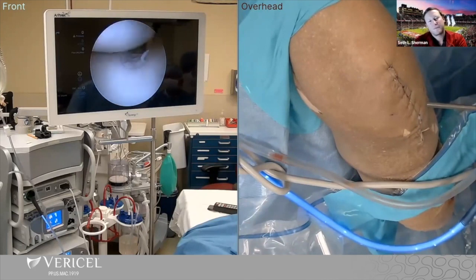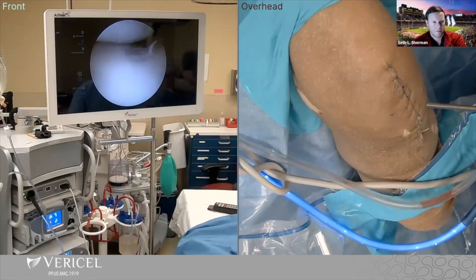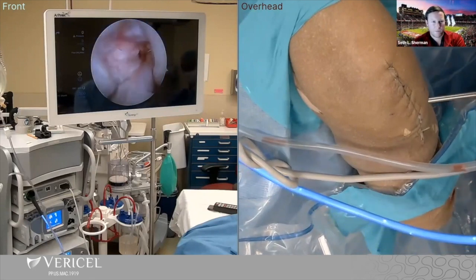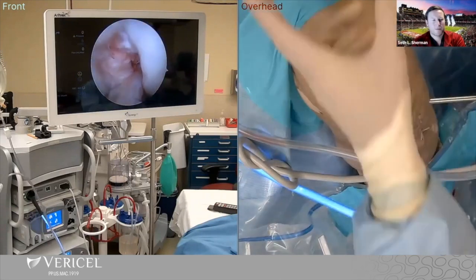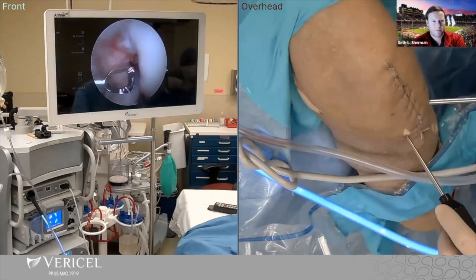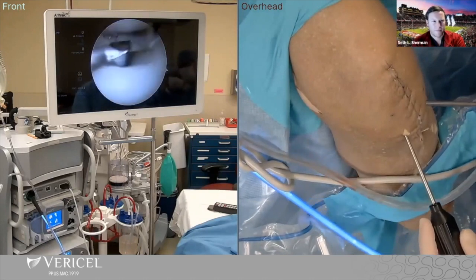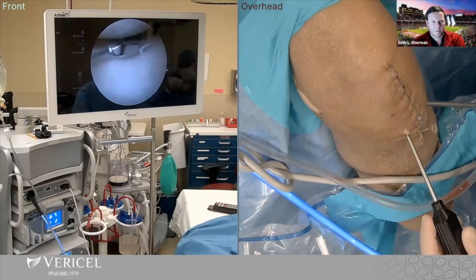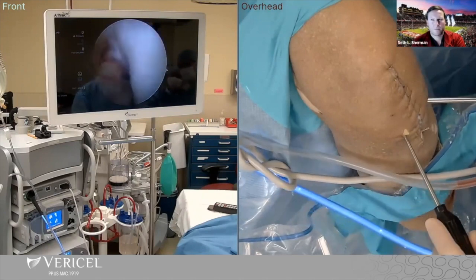I know you guys mentioned for your patellas — I'm similar. I'm probably liking that high 90% for doing osteotomy in addition for a patellar defect. But obviously I still look at alignment, TTTG, everything else. There are different ways to take this, but I did this from the intercondylar notches. I find it a little bit easier, and I do not take from the defect. There is some data showing about 60 to 70% viability from the defect site, so I like to do it from the notches.